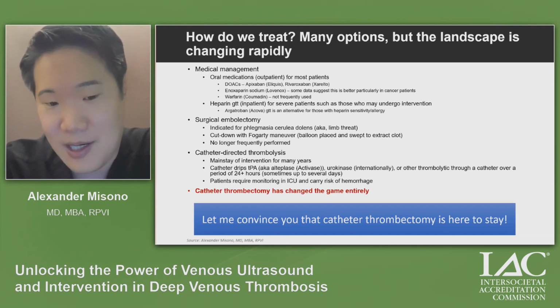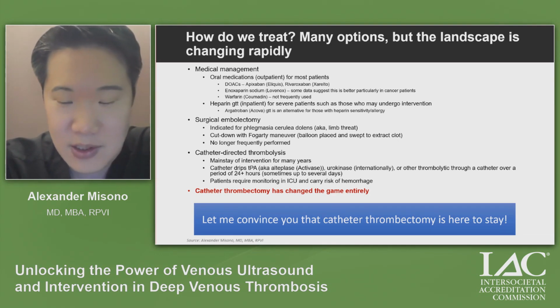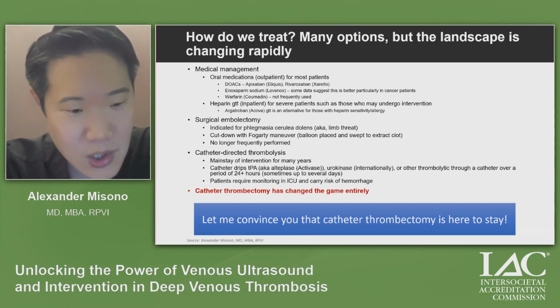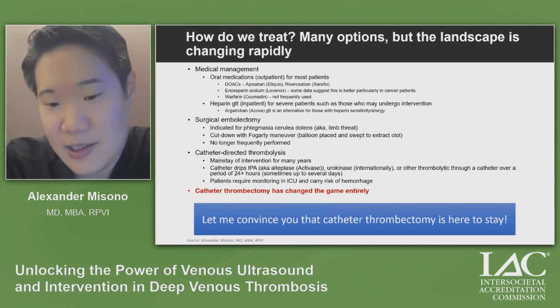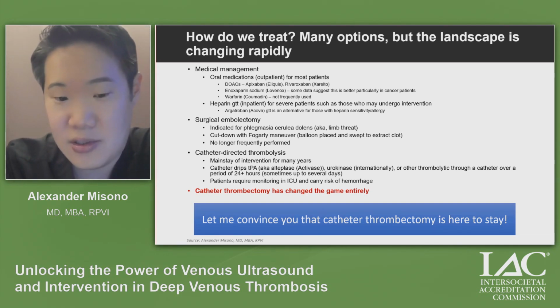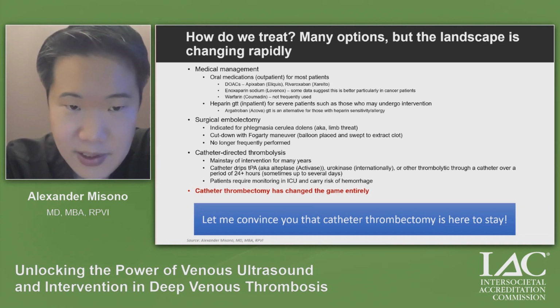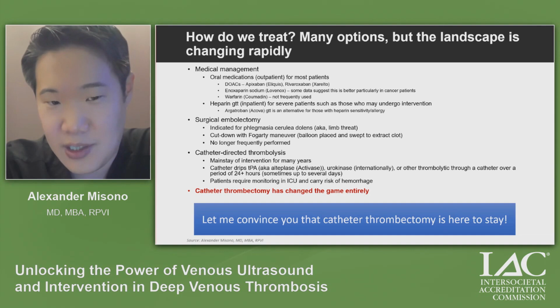That, at least in my practice, has also fallen out of favor, though, because it requires patients to go to the ICU and carries a significant risk of hemorrhage. So now that I've mentioned all of those, let me convince you that catheter thrombectomy should change everything, should change the game. I believe it is here to stay, and ultimately, I think it should change the way we scan our patients.